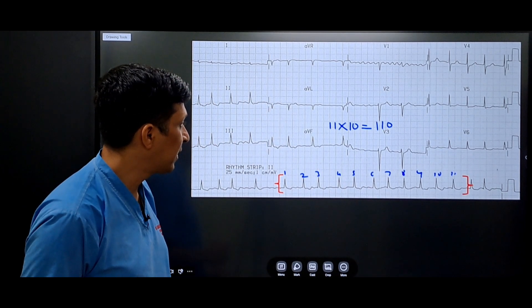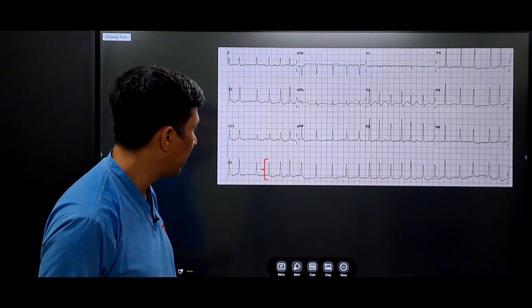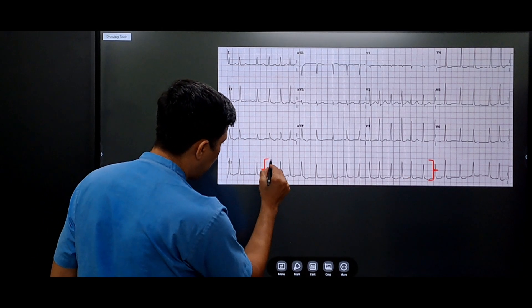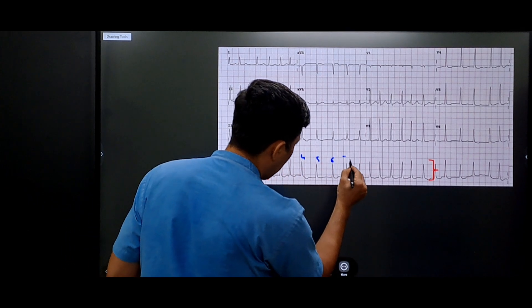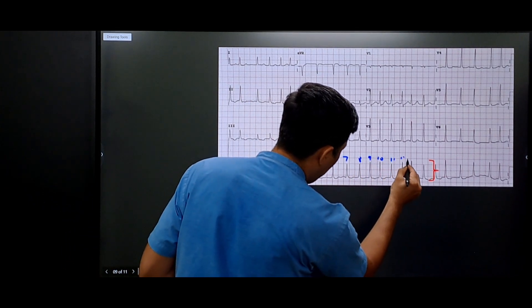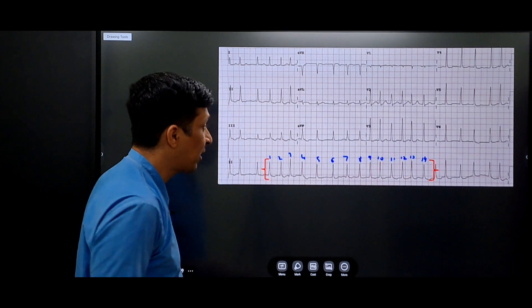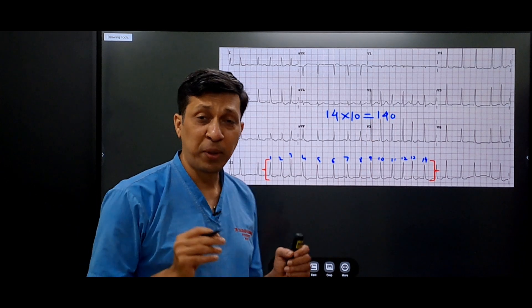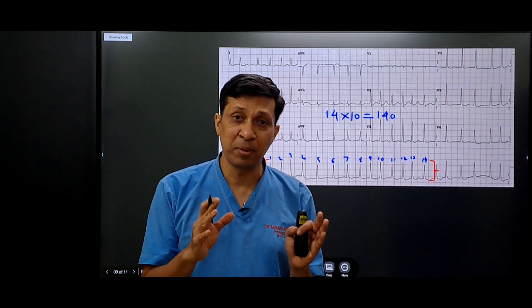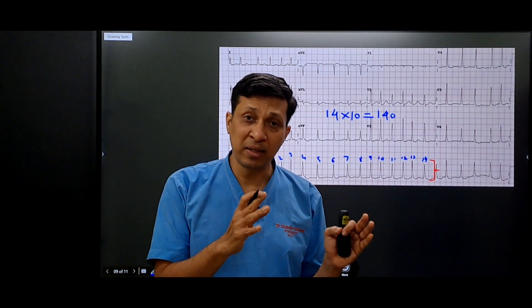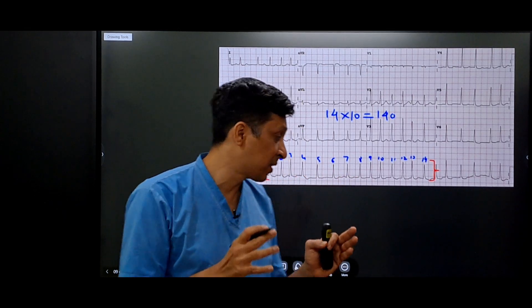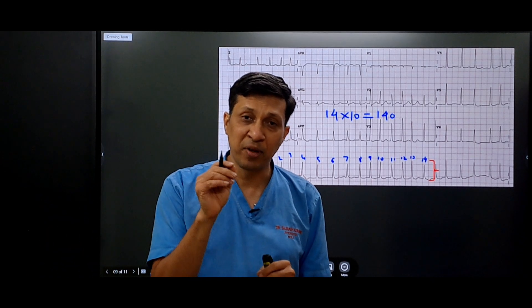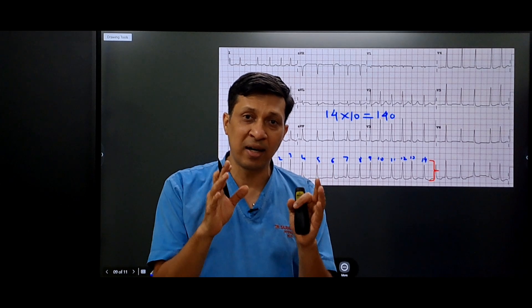Now we will see another ECG. If we calculate the 30 large boxes, the number of R waves are: 1, 2, 3, 4, 5, 6, 7, 8, 9, 10, 11, 12, 13, and 14. So the heart rate will be 14 × 10 = 140. One thing to keep in mind with this method is that there can be some variation when used by two different people, because it depends on from where you start counting your 30 large squares. But approximately the heart rate will be the same.